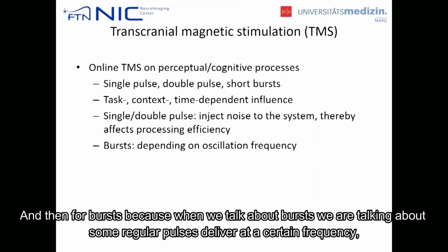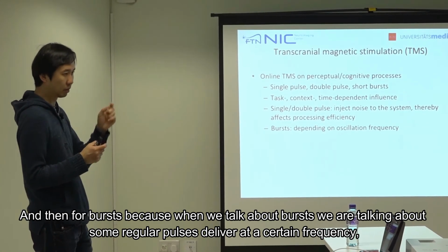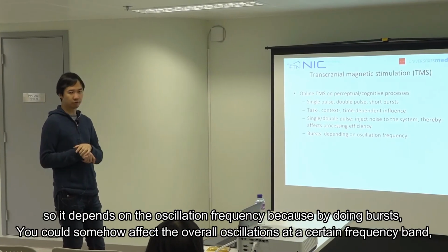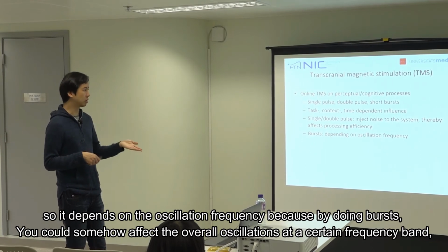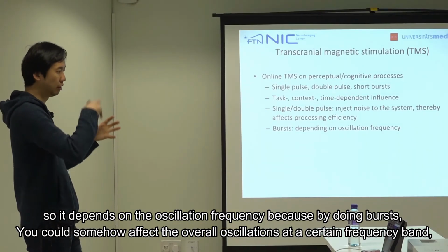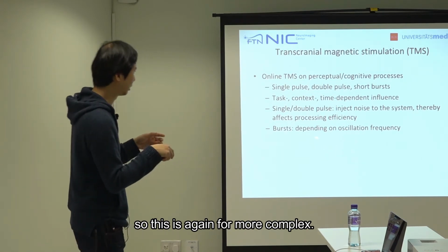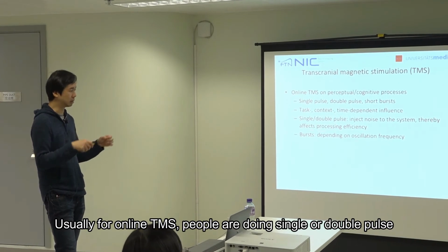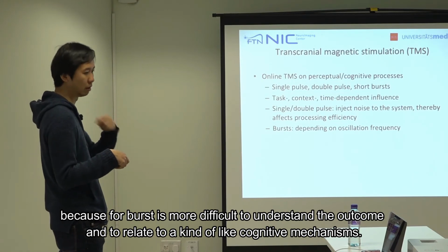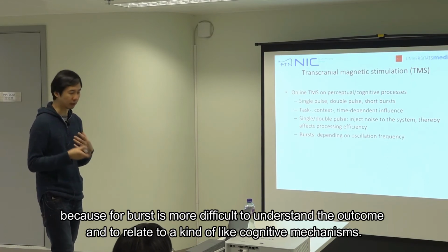And then for burst, we are talking about some regular pulses delivered at a certain frequency. So it depends on the oscillation frequency, because by doing bursts, you could somehow affect the overall oscillations at a certain frequency band. So this is again more complex. Usually for online TMS, people are doing single or double pulse, because for bursts, it's more difficult to understand the outcome and to relate it to cognitive mechanisms.